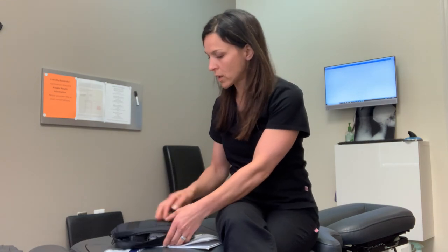Hey, it's Dr. Teressa Green with Align Chiropractic, and I am going to show you how to use your portable muscle stem unit that you received. I am not a representative of this company, nor am I paid by this company. This is just for my patients to use, as I have prescribed for their particular condition.